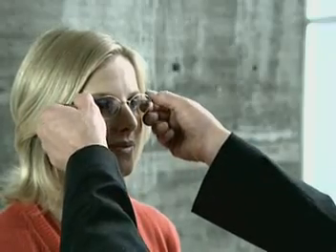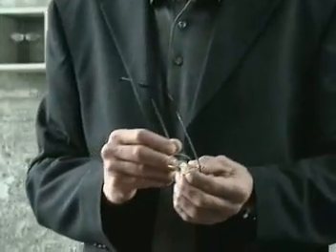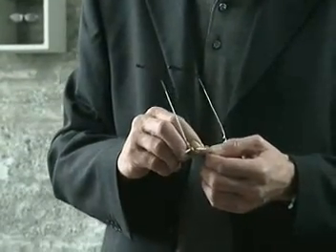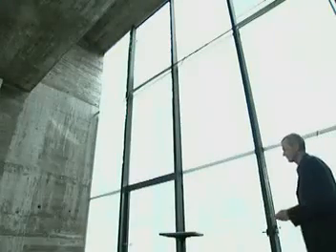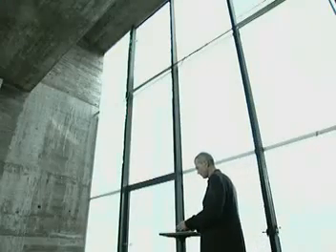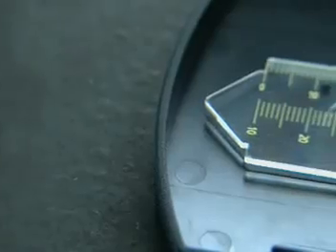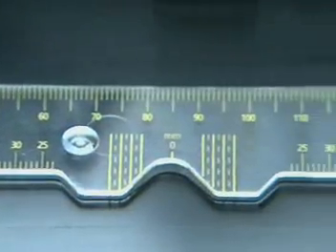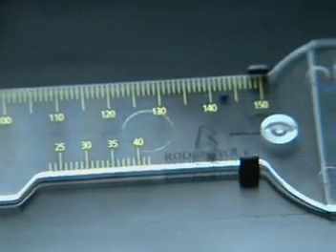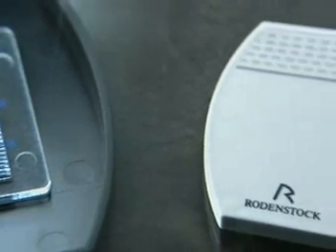All parameters depend on the selected prescription frame. Exact fitting before the measurements are taken is therefore of great importance. With Rodenstock's new measuring tools, you can determine the individual data in minutes. The values can be determined very easily using the CVD ruler and the specially developed measuring device for the dihedral angle.